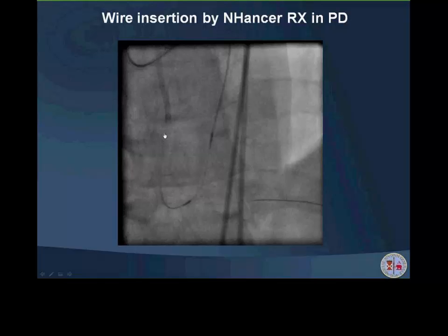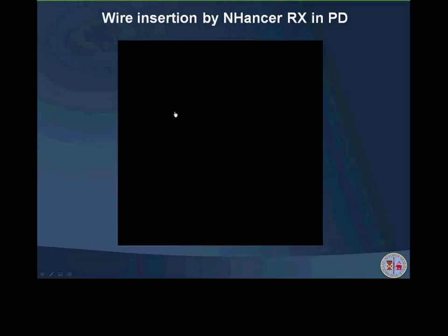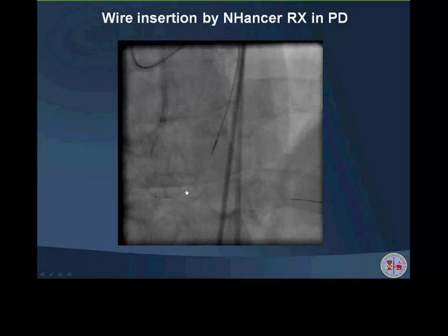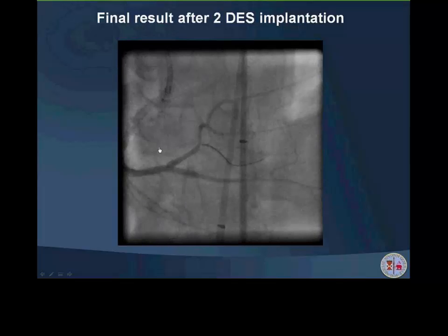The main advantage is that, doing like that, we are sure to use the same pathway of the retrograde wire crossing. And this allows us, after withdrawal of the dual lumen catheter, to have the wire used for retrograde approach and the antegrade wire in PD, and to use these two wires for reconstructing the bifurcation. I think that nowadays, for those people who are using retrograde approach, it is very, very common to use a dual lumen catheter to recross and to gain the two branches easily. And I would say in much less time, less contrast consumption, less radiation dose as compared to the past.